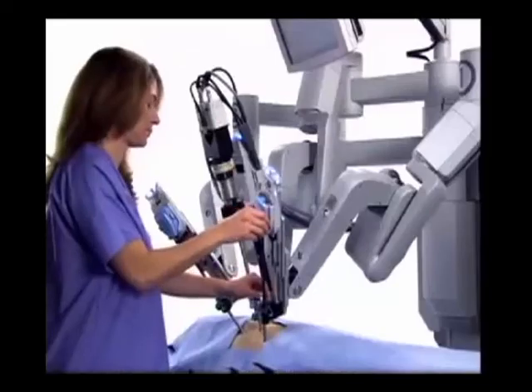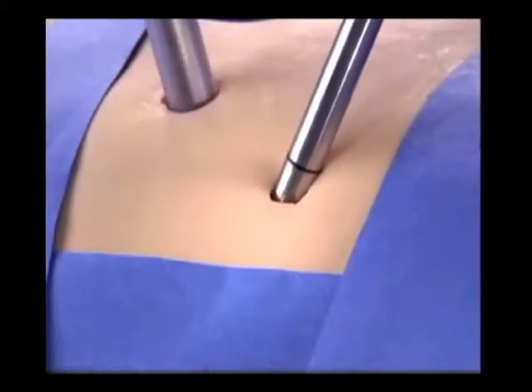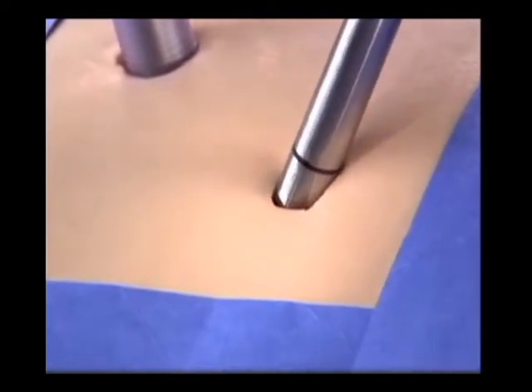All right. So you deal with tremors. Then the other benefits that the patient would get, the size of the incision on the patient. Oh yes, absolutely. What differences would one see there? From an open prostatectomy to robotic, there's a lot of difference. The incision in an open prostatectomy is from the umbilicus down to the pubis. It's a big incision to take out a small prostate. With laparoscopic and robotic, the skin incision is only half an inch, but in 3-4 places. Eventually, these will mix up with the skin, and it won't be seen at all. So that's one big advantage with this robotic approach as well.